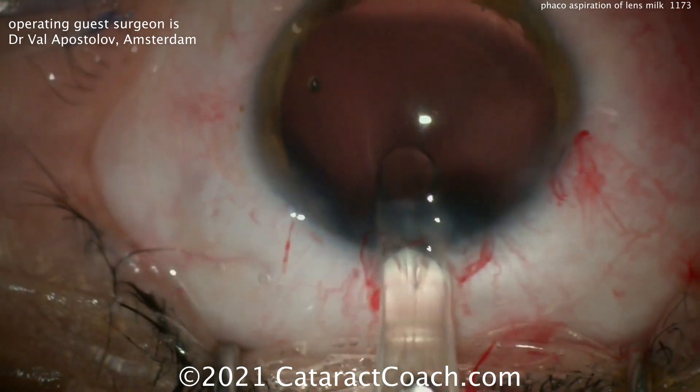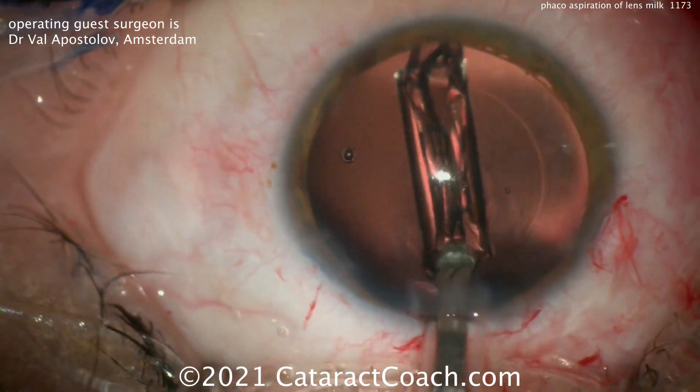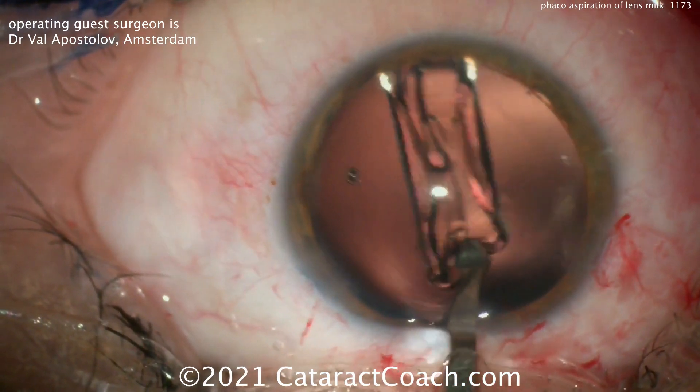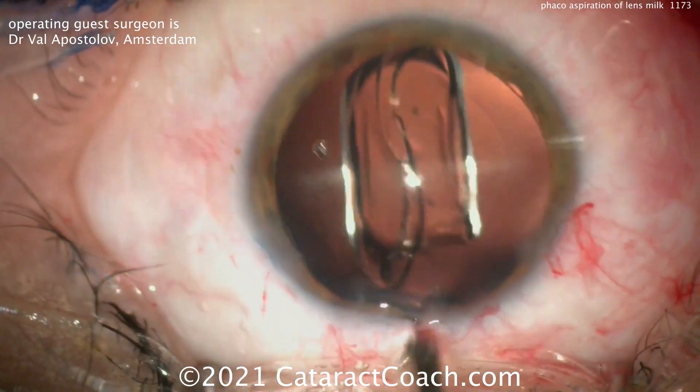Inserting the lens — looks like a single-piece acrylic lens going right into the capsular bag. Beautiful result. However you deal with these intumescent cataracts, the key message is to make sure that the intumescent fluid is somehow aspirated and the capsular bag is depressurized.